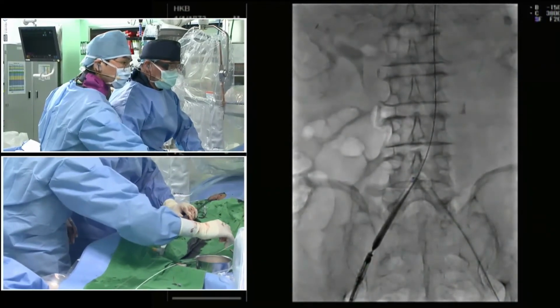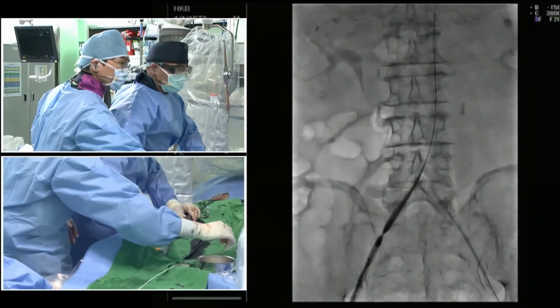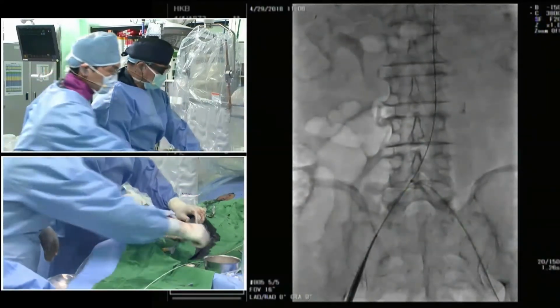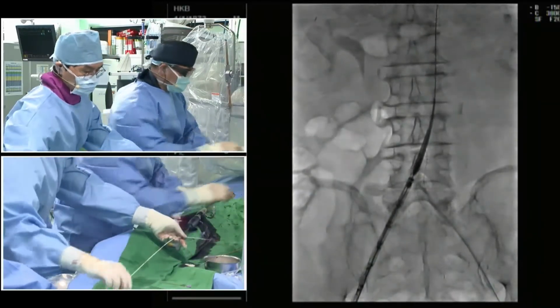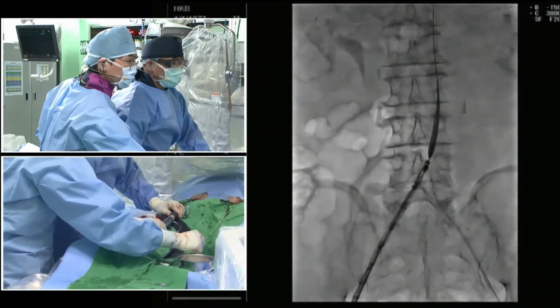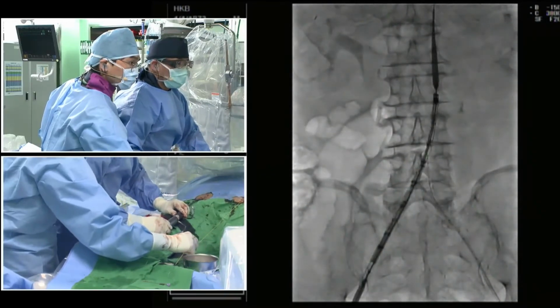Okay, so we are inserting. For the audience's benefit, that's done first because that's your contralateral limb. It's attached to that yellow wire that was snared. And the operators just have to be careful not to twist and rotate and wrap that yellow wire, to make sure orientation is maintained in the AP plane.